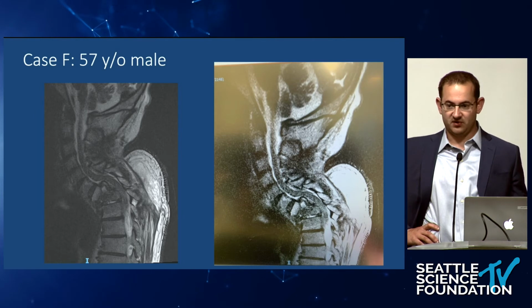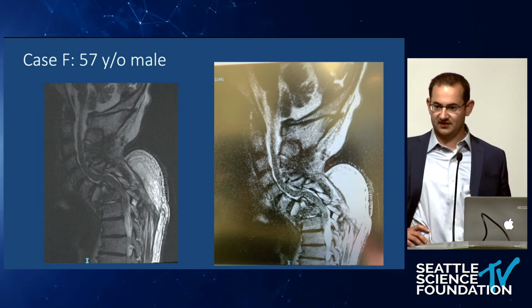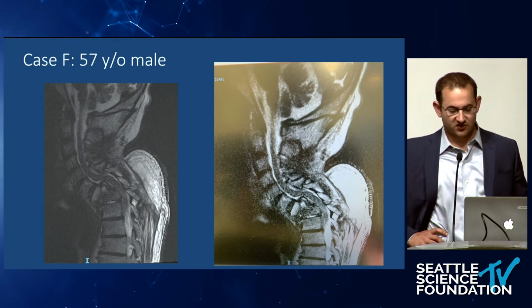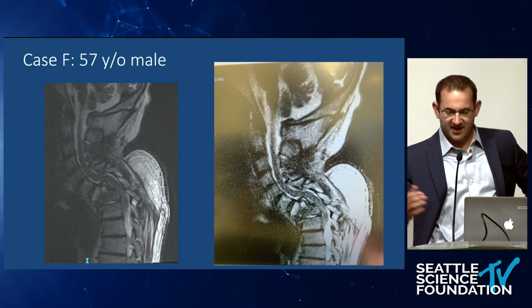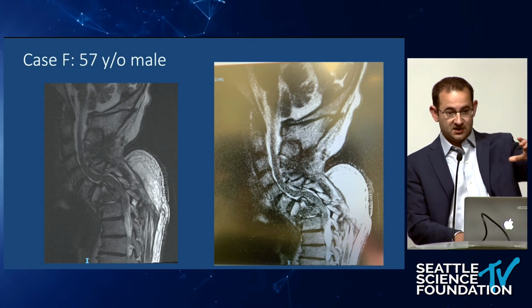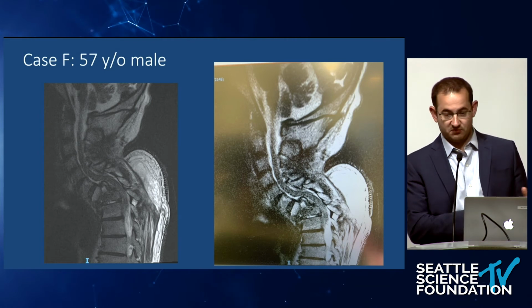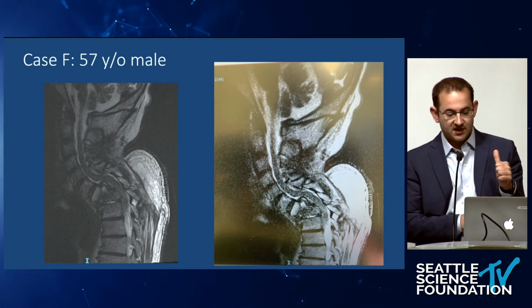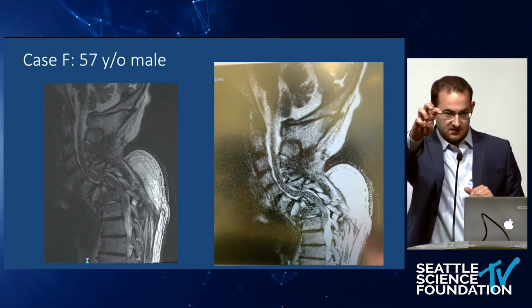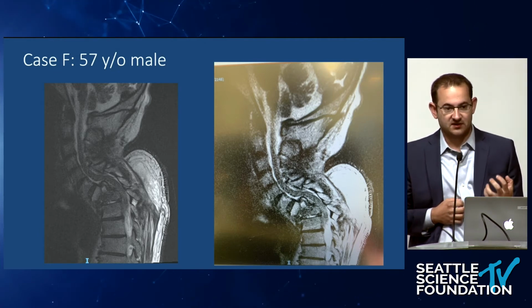He's got a draining fungal wound, and doing a massive 2-level VCR, is that a reasonable approach? Just to tie in Bob's multi-rod talk, what I ended up doing is putting him in that same halo kind of setup, which I showed before, where we're driving his head into extension and then pulling it in traction. I'm essentially pulling his head out of his chest with this.